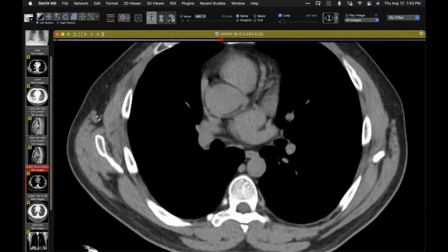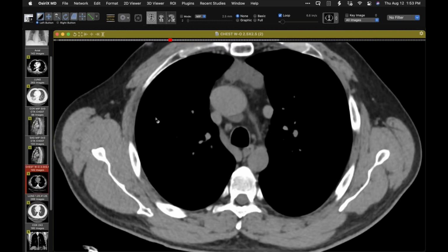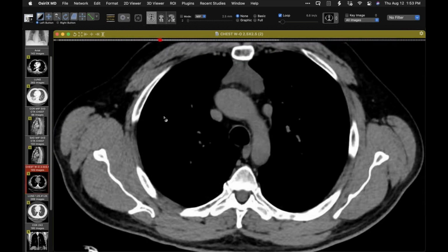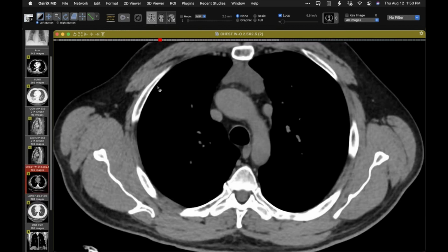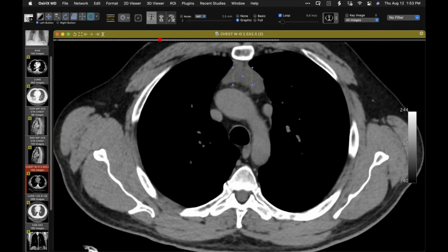So, if you look at Reggie Munden's incidental paper, the last time I looked for stuff in the anterior mediastinum or prevascular space, if it's cystic, they say no further workup necessary. I think, right? There's not even a single follow-up period. Yeah, I'm trying to remember. Somebody's going to have to fact check me on that, but yeah, I totally agree. I can usually talk them into doing a limited CT or an MR annually, just until they're satisfied.